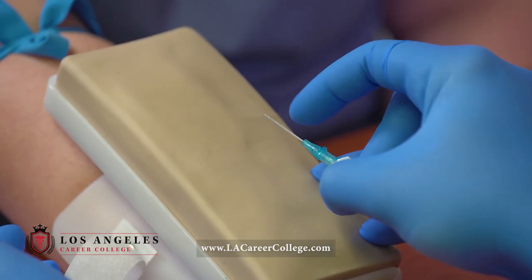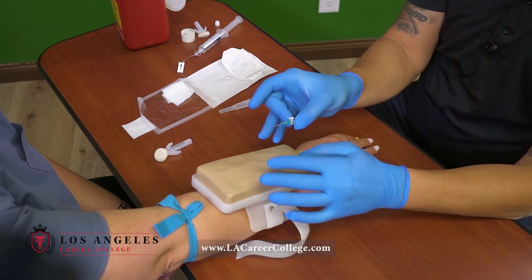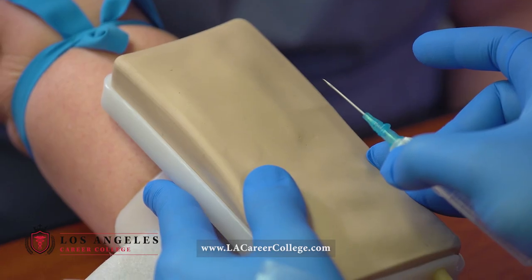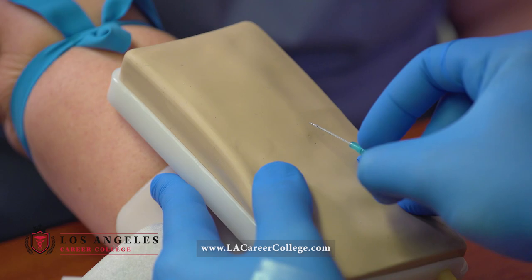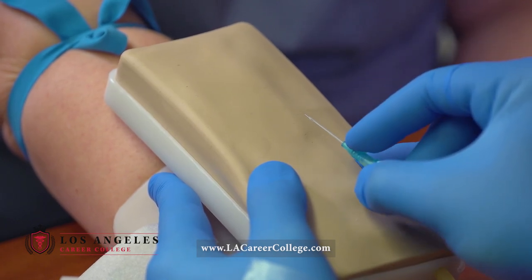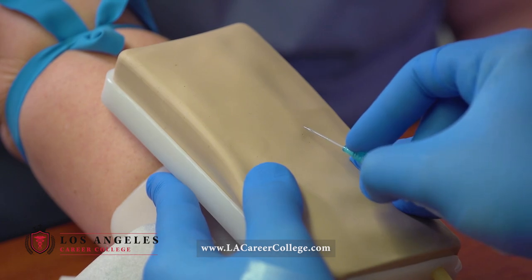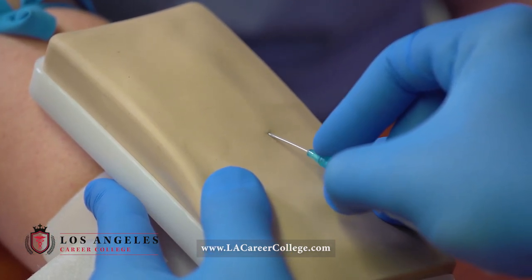Your index finger will go ahead and advance the catheter. Another key point to remember: do not move your non-dominant hand until you advance your catheter. As you're going in, bevel needs to be up. If it's a deeper vein, you're going to go about 30 to 35 degree angle. If it's a shallow vein, then you will go about 10 to 15 degree angle. For me, this is a deeper vein, so I will go about 30 to 35 degree angle. Do not move your non-dominant hand finger until you advance the catheter.